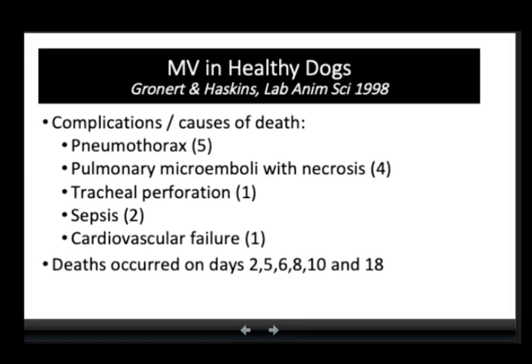With this ventilation, they noted that the following complications occurred: pneumothorax in 5 dogs, pulmonary microemboli with necrosis in 4 dogs, tracheal perforation in 1 dog, sepsis in 2 dogs, and cardiovascular failure in 1 dog. 8 of 17 healthy dogs died, with deaths occurring on day 2, 5, 6, 8, 10, and 18 from the start of ventilation.